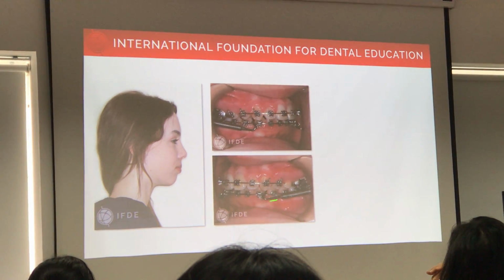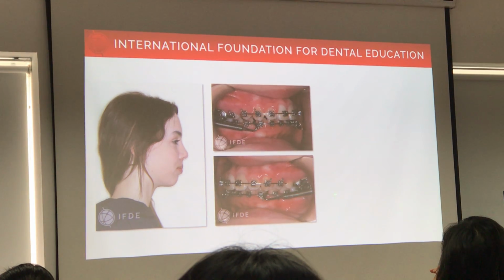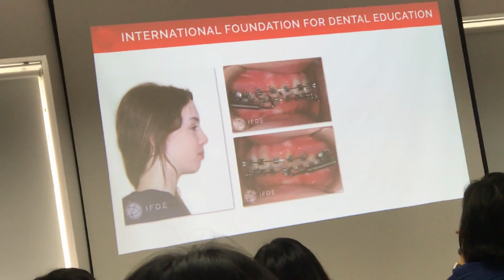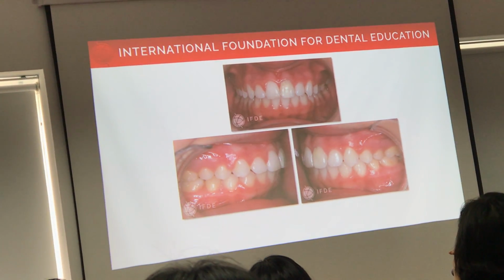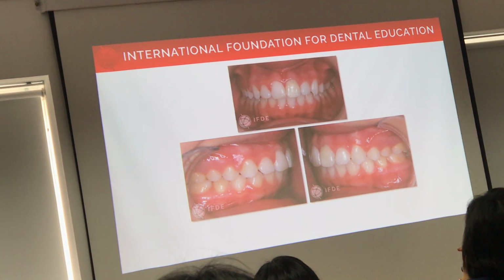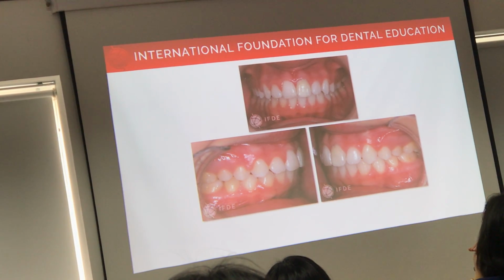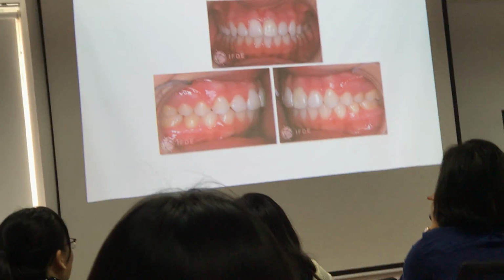I cut the wire, I went this low, or you can just follow the instructions. You have to be more creative. In this patient, the wire was cut at teeth 4 and 5 to rotate the posterior group of teeth distally and let the anterior teeth find their own occlusion. And that's the way we finish her. That's okay. So we have a good one, you can see that base up. And this is the end of this case.